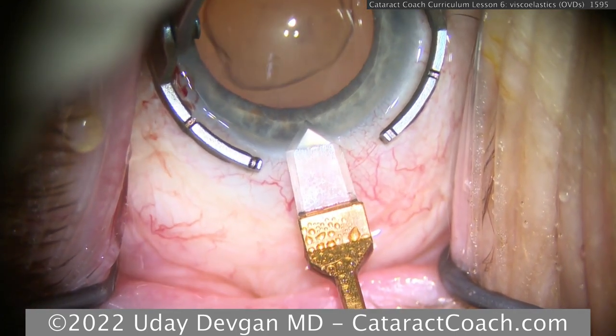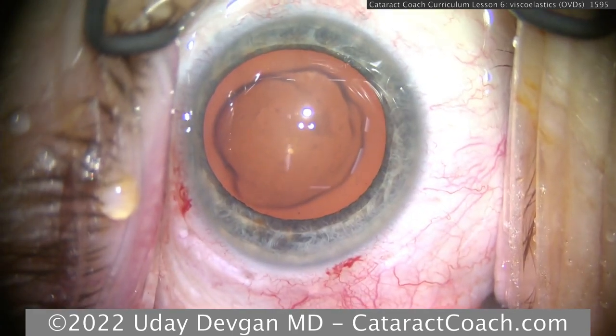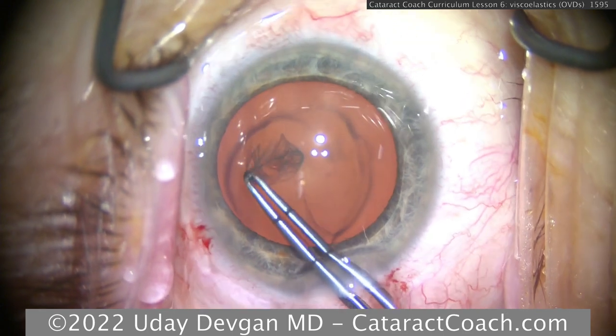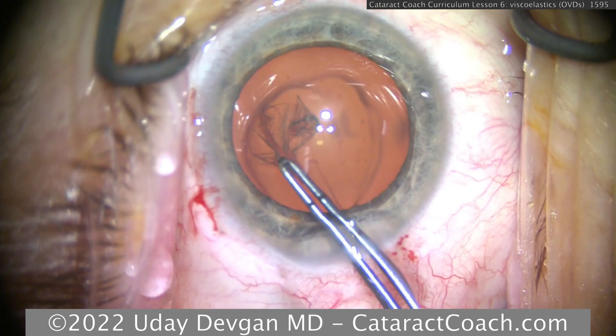Main incision being made here with a diamond keratome. Now watch that central bolus of the cohesive viscoelastic. And as we maneuver in the eye and slightly open the incision, we'll lose some of that. And that's to be expected. So we're going to tear a continuous curvilinear capsulorhexis here.